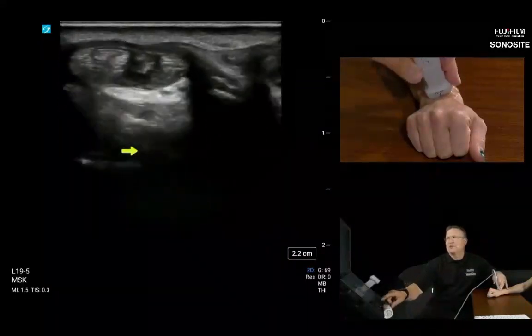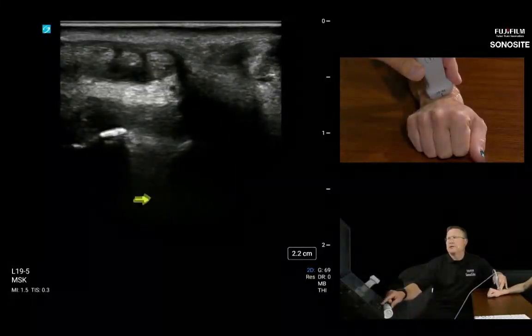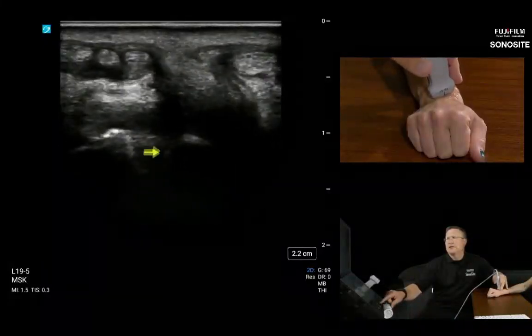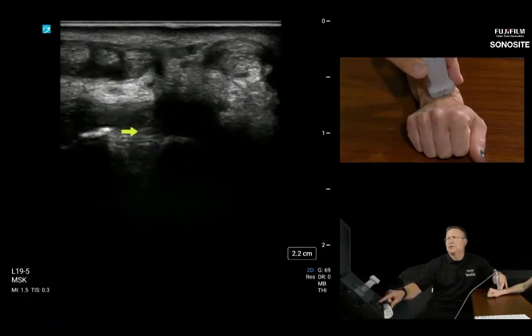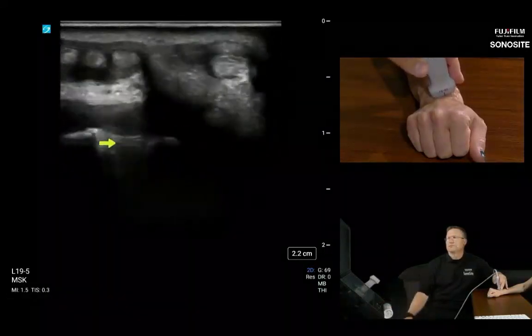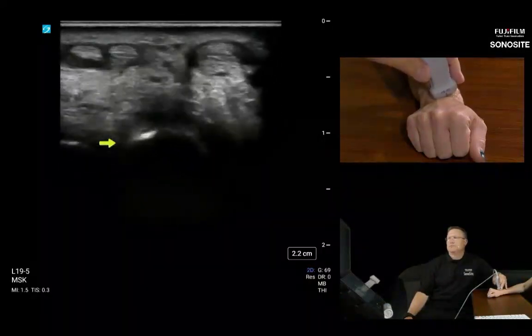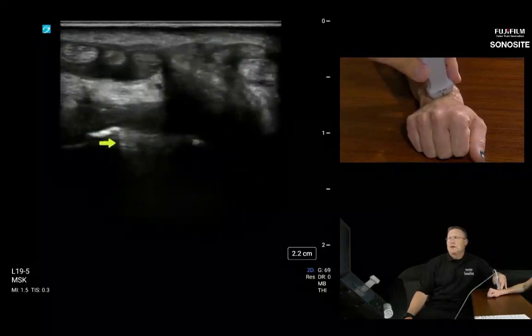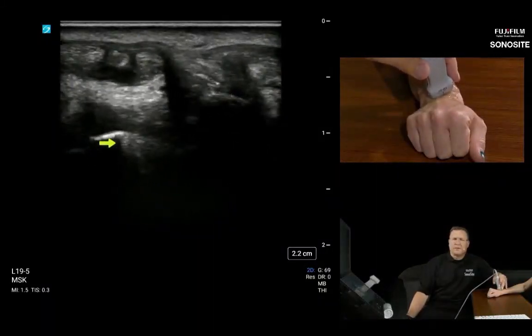We have a superficial ligament and a deep ligament down here that we don't see a lot of detail in, but the superficial ligament is very easy to see, which is this band right here. And that sums up the dorsal wrist exam, at least on a basic level.